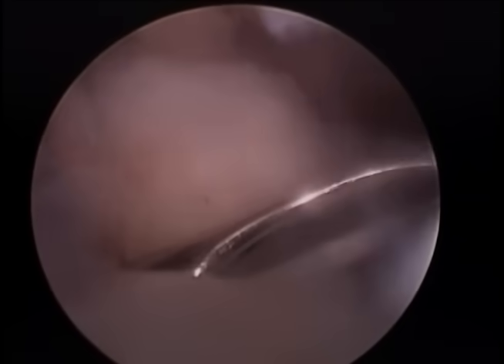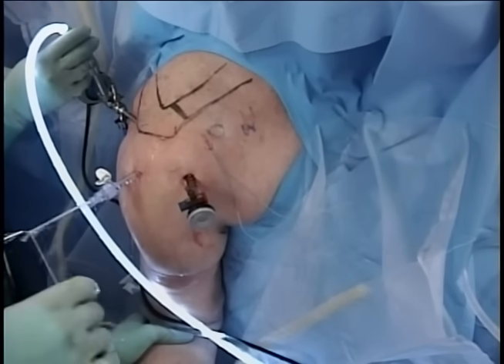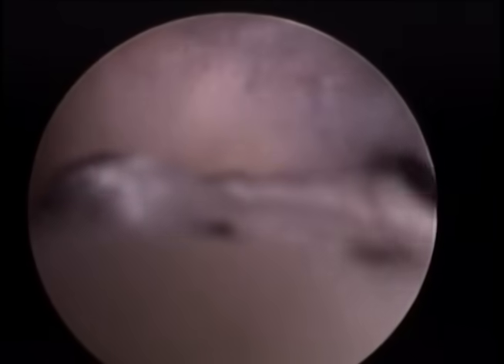We tie half hitches, which are multiple knots, on top of this knot. You see us tying outside the cannula, and this will really tighten the knot down and cinch down the rotator cuff down to the anchor.